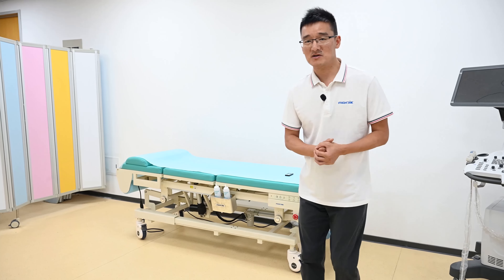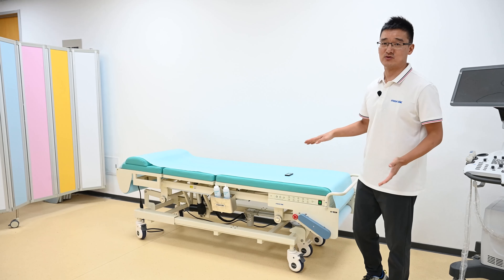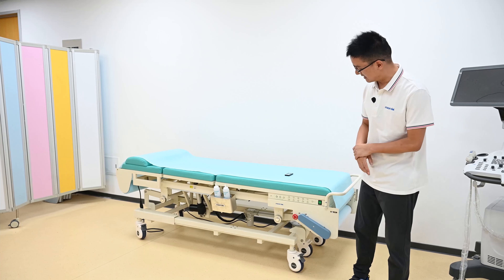Besides the unique functions, the table also has functions for height adjustment, Trendelenburg, and reverse Trendelenburg. Let me operate it.